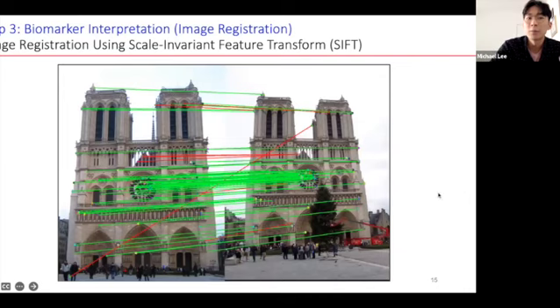And that's when we use something called image registration, specifically scale-invariant feature transform, to align the different images. And this is a good analogy where a picture of a cathedral was taken from two different vantage points. And ultimately they're of the same object, but they're two different images. Similarly, our whole slide images, our tissue sections, are from different cuts of the tissue. And so there might be slight differences. And so by using scale-invariant feature transform, we wanted to see if we can align and match different features of the two different images together.